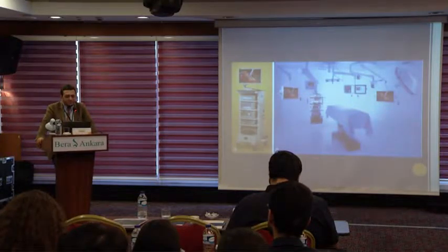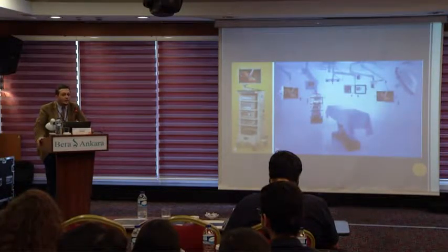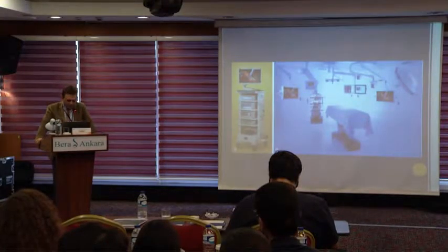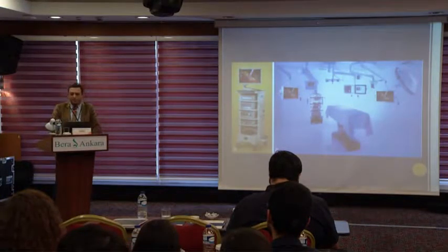But if you have the chance of using an integrated operating system, like in picture B, it could be more comfortable, of course. But it's up to the economic capability of your hospital or your department.